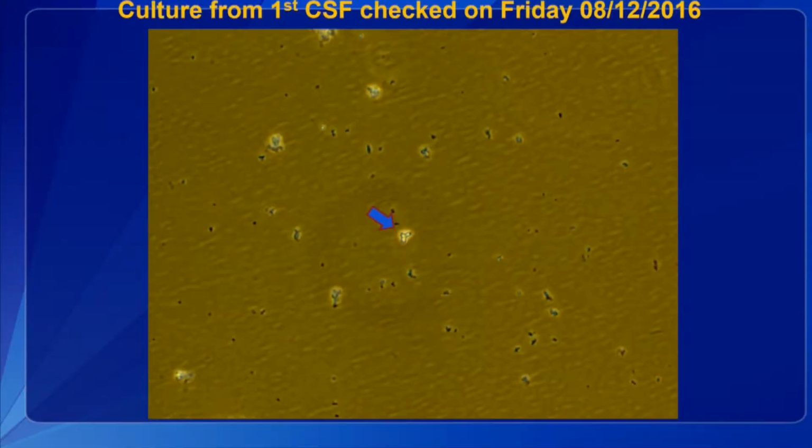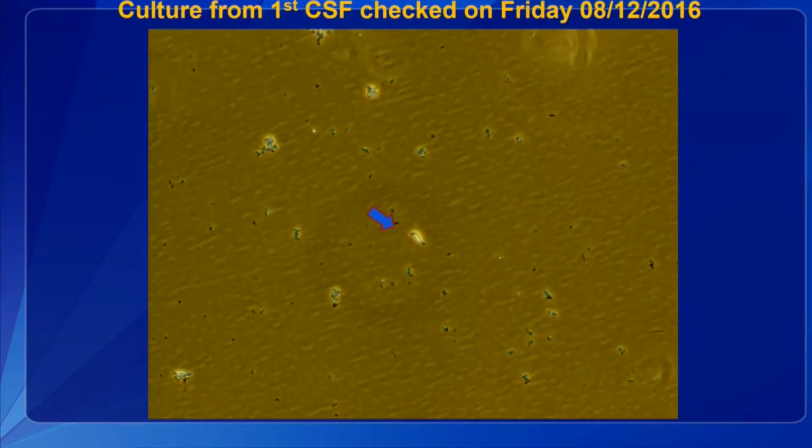So in addition to doing PCR with the CSF, can you please run this video? This is a video. Yeah, so in addition to doing PCR, we put all the CSF in culture, and only the first CSF was positive. You see this movement.